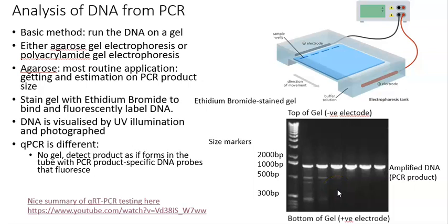And then the other difference that the SARS testing system uses is reverse transcription PCR, where we've converted RNA to DNA, and then we've performed our PCR. And we are doing that PCR quantitatively, so we can actually find out people who've got lots of virus versus patients who've got very, very little virus. And that's going to be important when we talk about sensitivity and specificity next week.